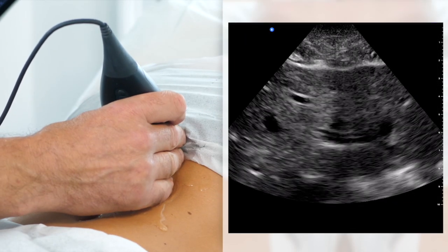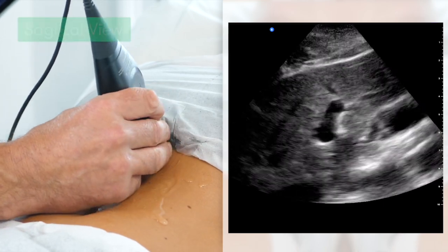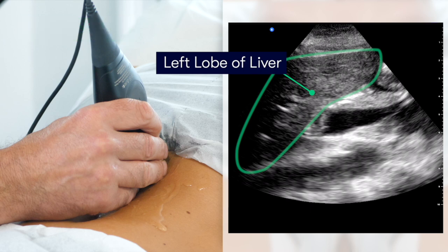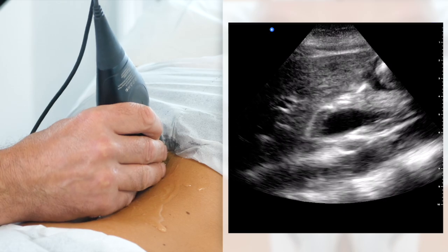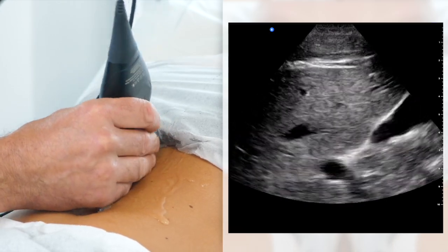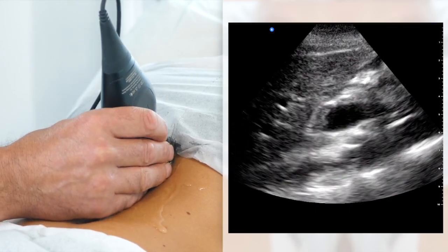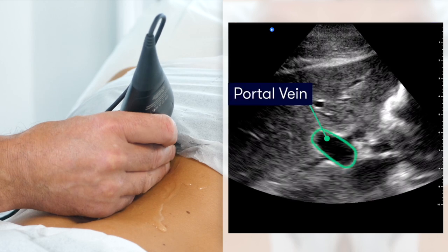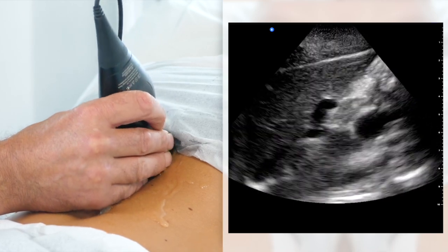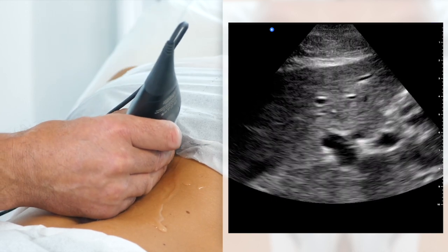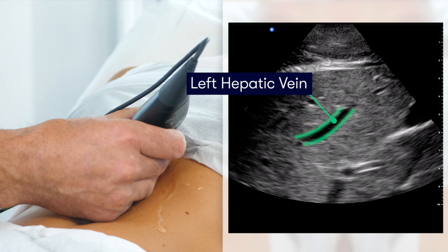Going from looking in the transverse plane over the epigastrium, we're now going to look in the sagittal plane. We can see the left lobe of the liver going from the right side through to the left side of the image — the triangular shaped structure in the foreground. Within the left lobe of the liver, we're again able to visualise the portal veins, which we can recognise due to the echo bright margin on their walls. As we go more to the right side, we can see the left main hepatic vein, which doesn't have echoes in the wall — this is how we tell the difference between hepatic veins and portal veins.